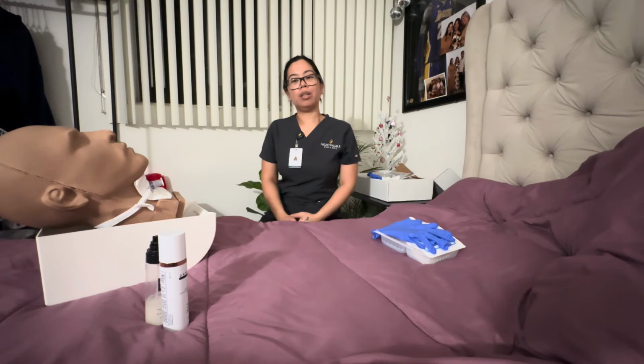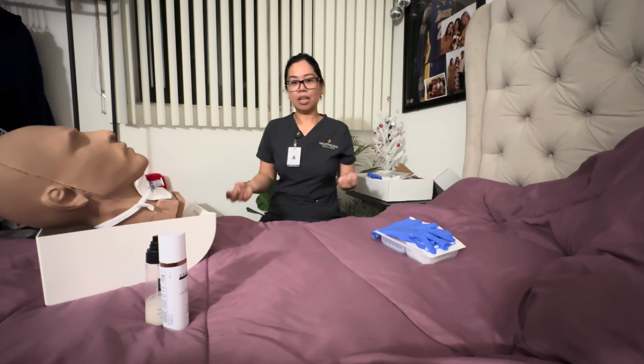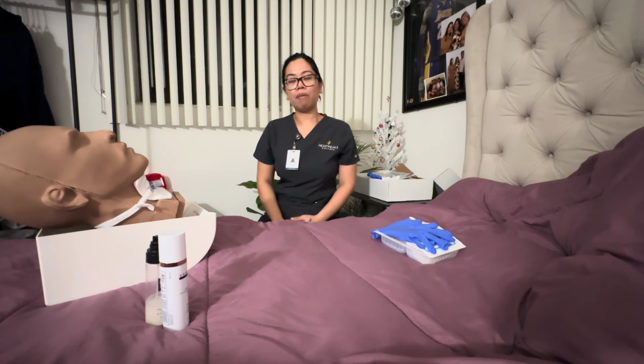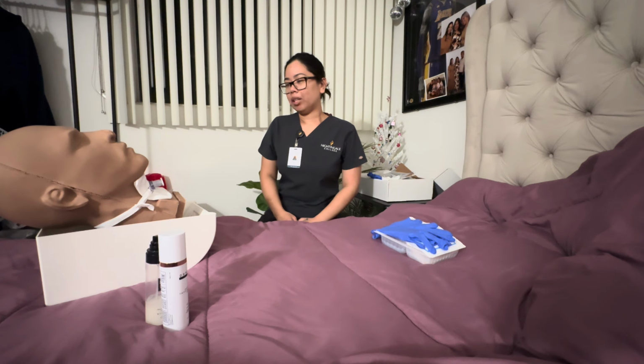For this patient, we want to elevate the height of the bed for the working space, and put the patient in a semi-Fowler's or Fowler's position, at least 30 degrees, in order for us to do the tracheostomy care. Then we are going to pre-oxygenate this patient for about 30 seconds to 1 minute, so they have an oxygen cushion while we do the treatment.